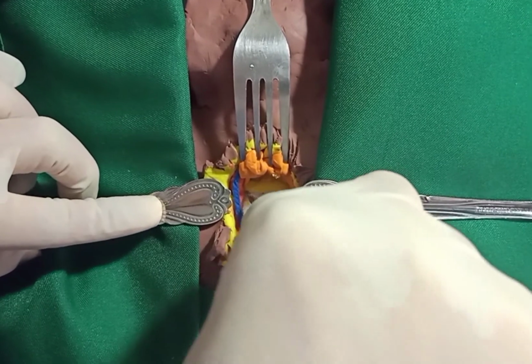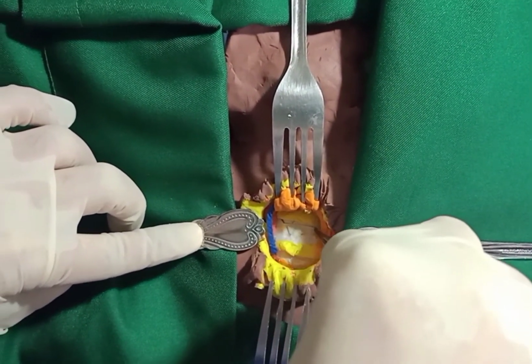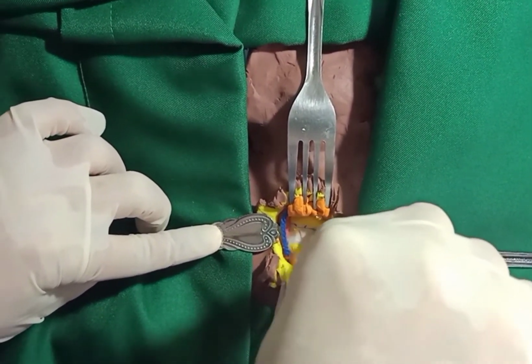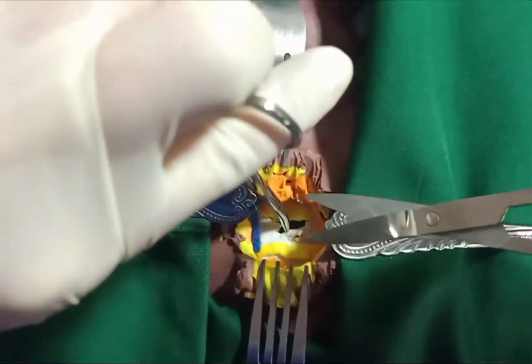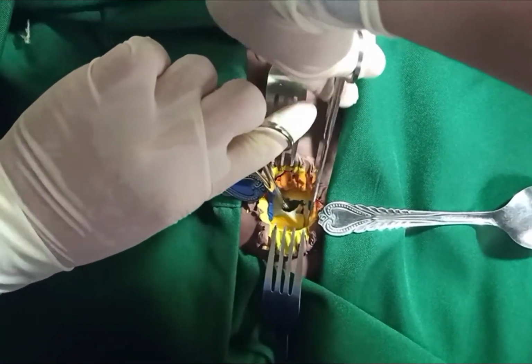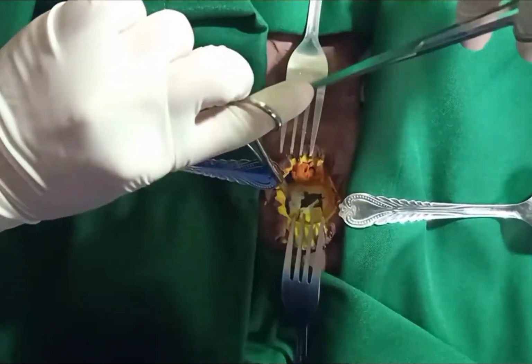The safest tracheostomy in adults is to create an inferiorly based flap raised from the anterior wall of the third and fourth tracheal rings. This is called the Bjork flap, which is an inferiorly based flap to prevent the false passage of the dislodged tube when we are replacing it.